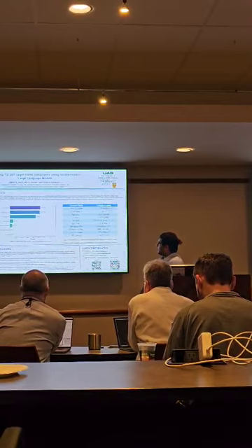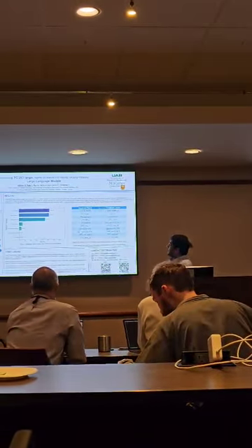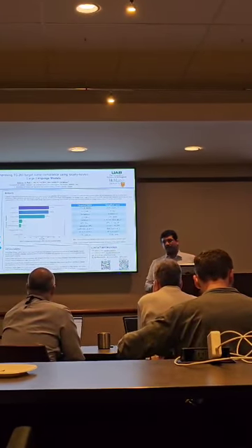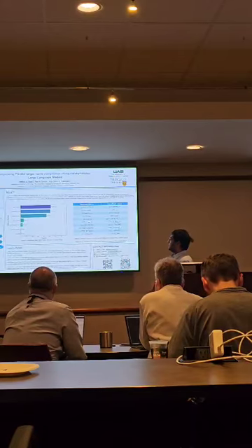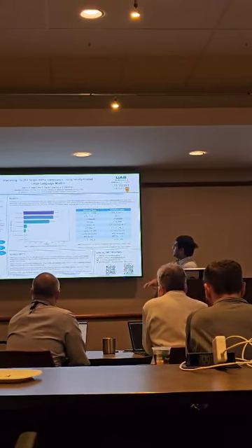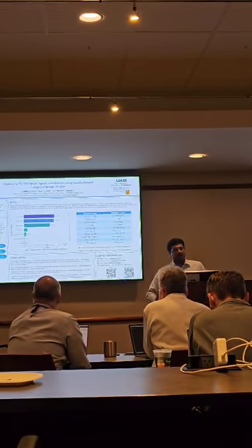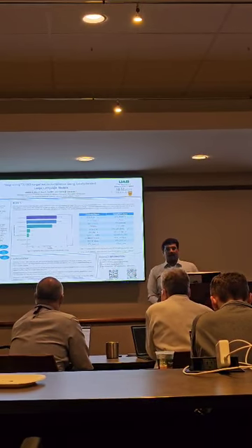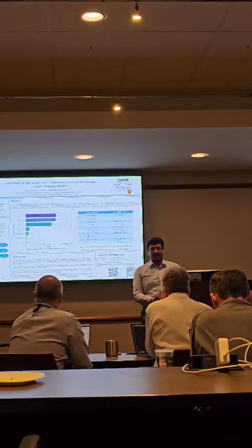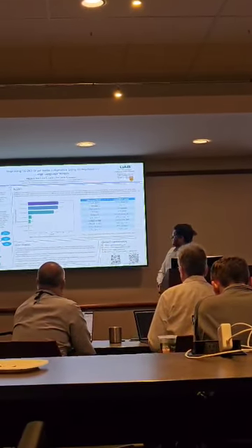So the conclusions are we were able to get a pretty good average correction rate across 1,000 sample structures that we took from here at UAB that weren't previously compliant. It took about 89 seconds if we used a single model approach. Using a mixture of prompting experts, we got around 22 seconds per correction. So we're trying to drive that down, really build a C# tool that can sit natively right where the physician's naming it and provide those corrections in real time. So that's the first one.